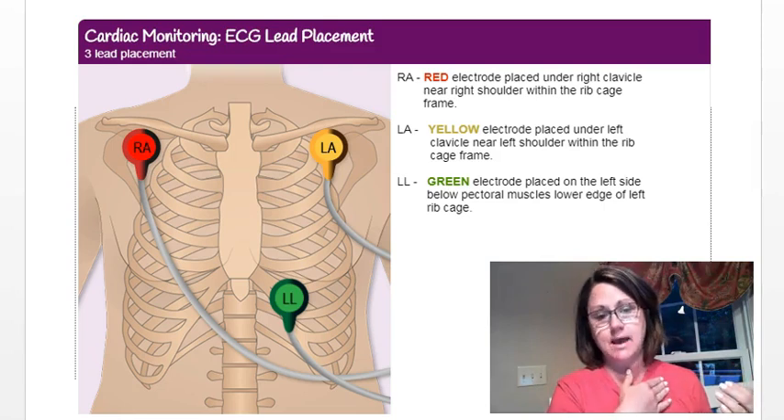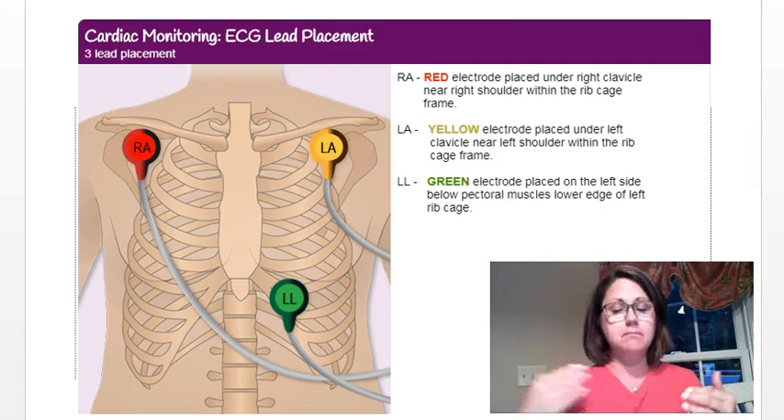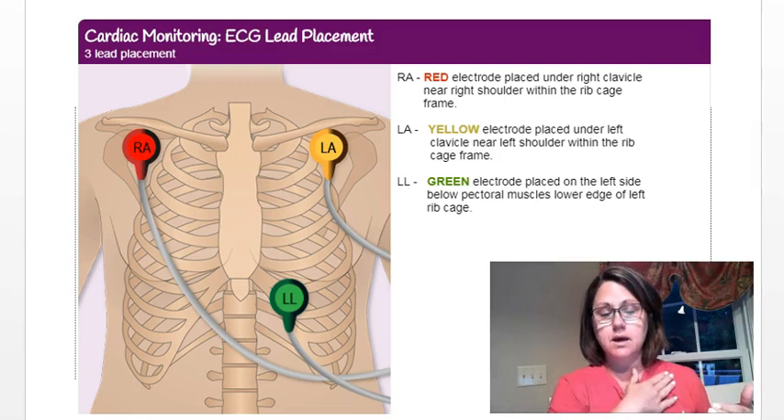The same principle applies on both right and left sides. On the left, the yellow lead goes near your left clavicle — that's your left, my right — and that's how you want to place that.